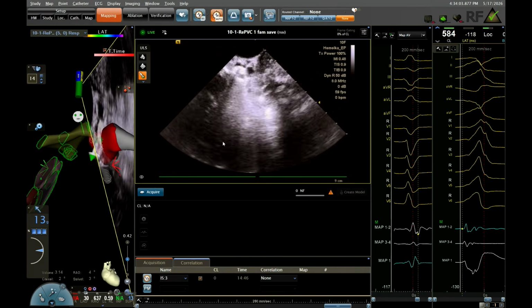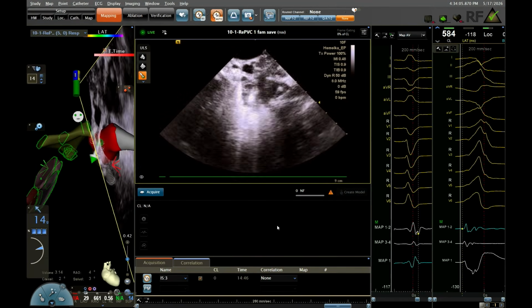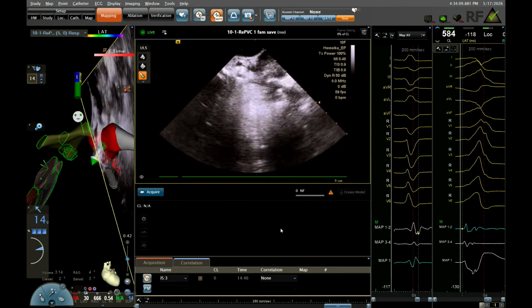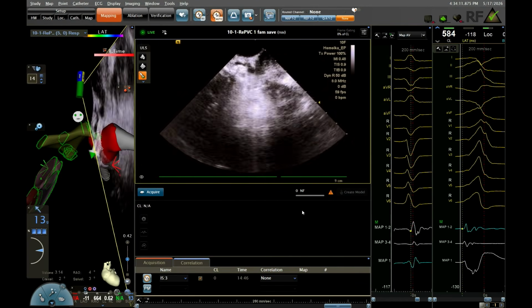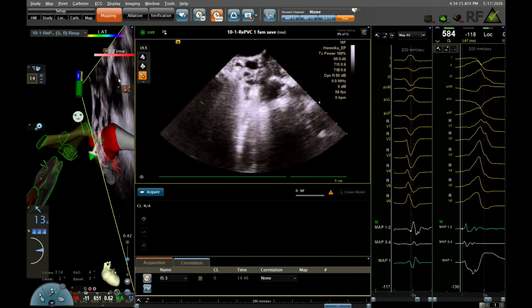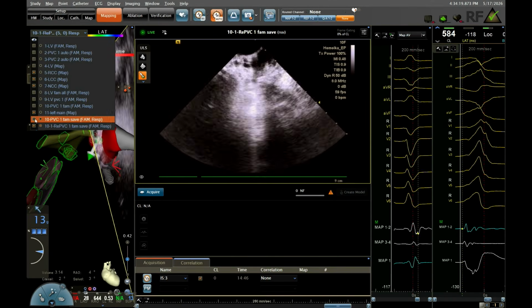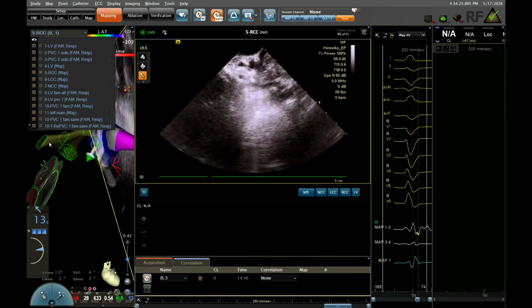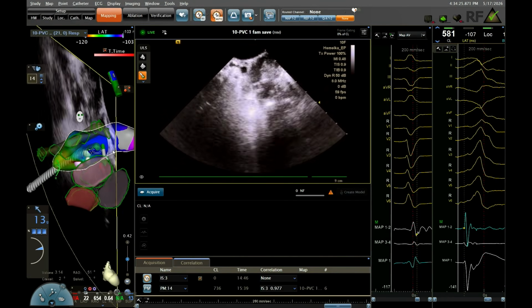And that's the relationship we saw today in the anatomy lecture, okay? So we know here that this is true LV summit. And in true LV summit, our activation is not that great. So what we did, why don't you show your activation map? And I don't know if anybody has any questions about this view, or you want to add something, my friend, or we can say more. But we did an activation map.